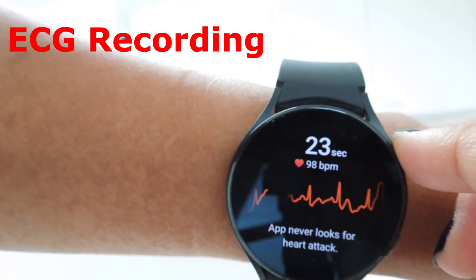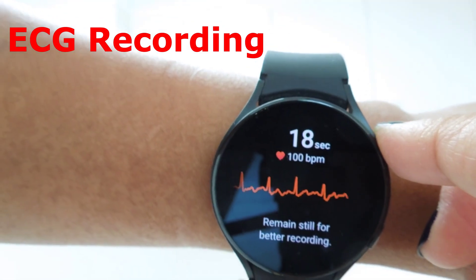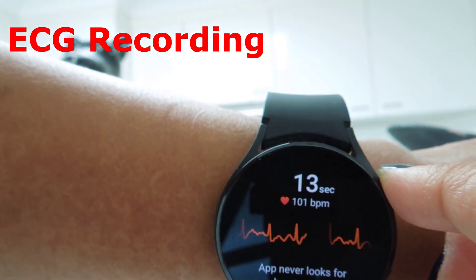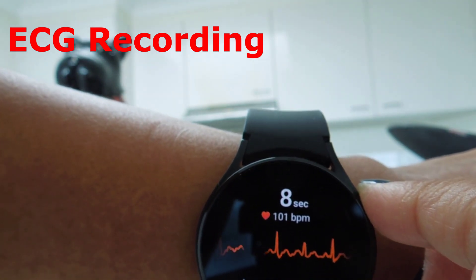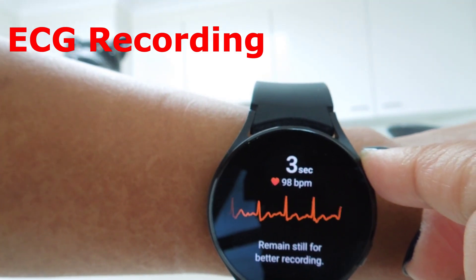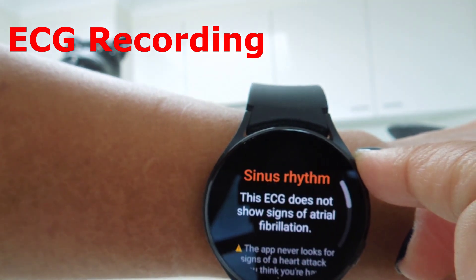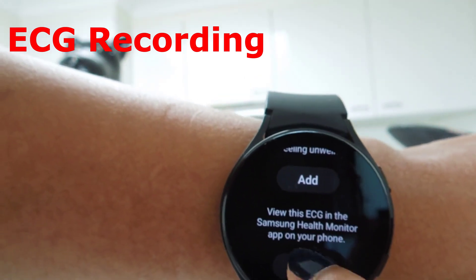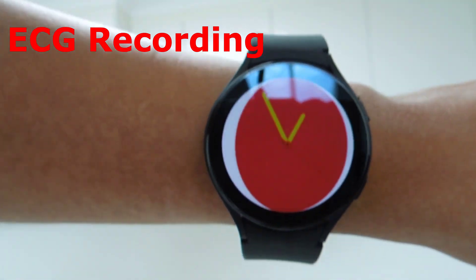These recordings are stored in the Samsung Health Monitor app — we'll look at that shortly. I've completed the second ECG recording. Make sure you click the done button so the recording gets saved to the app. I don't want any more recordings so I go back to the home screen.